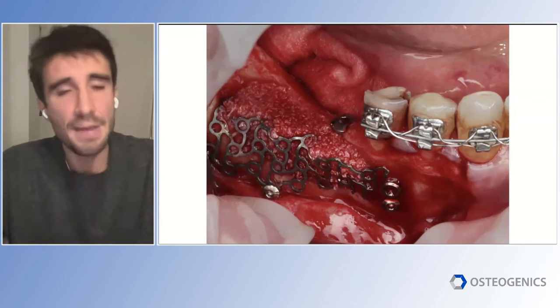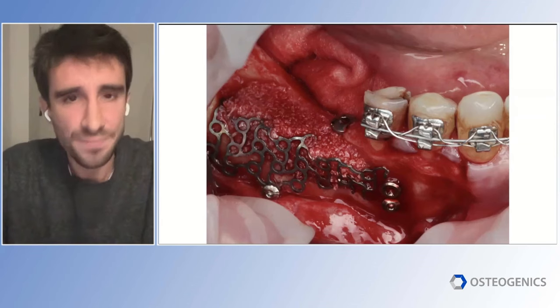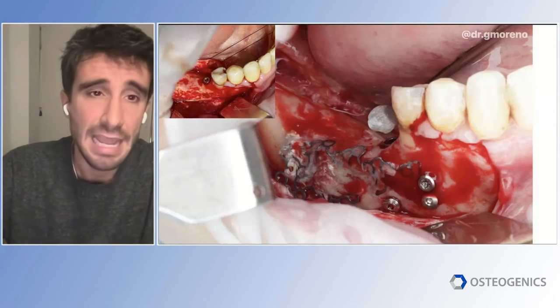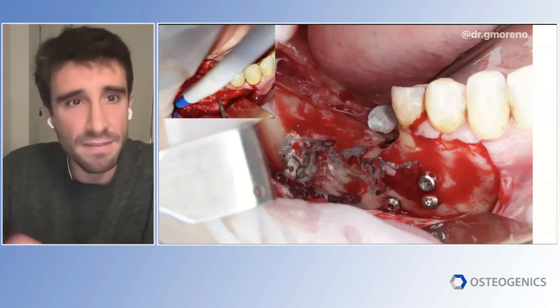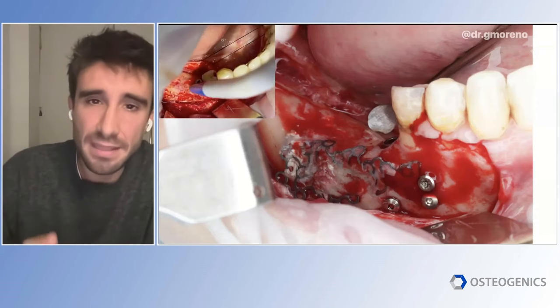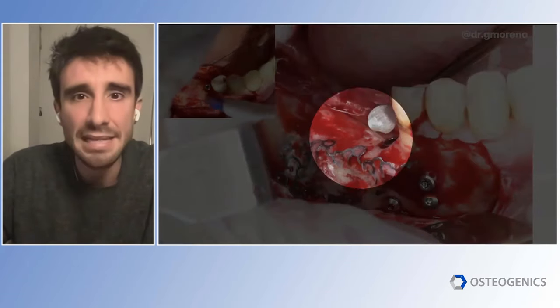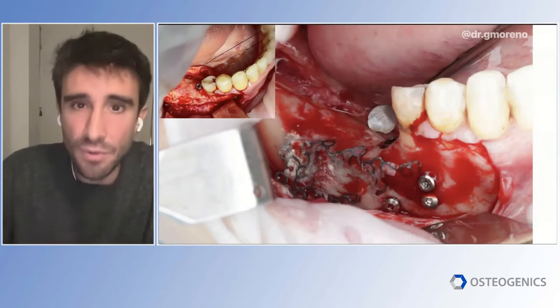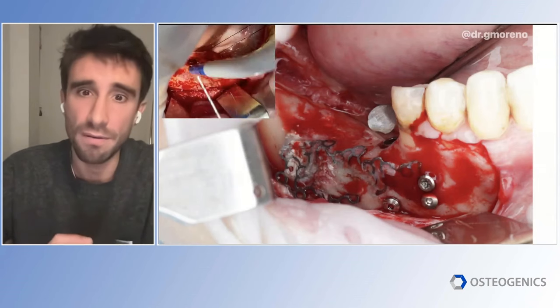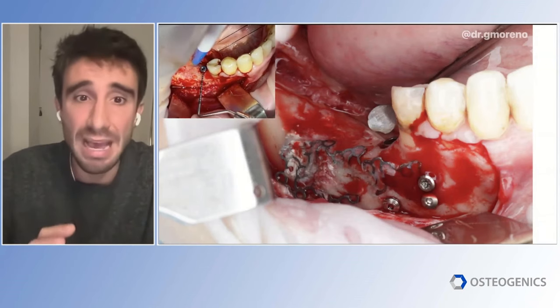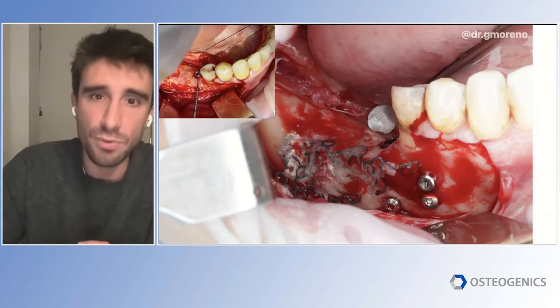The position of the titanium mesh exactly matches what we planned, creating exactly the intended volume and grafted area. We fill the space with 100% xenograft and cover with a collagen membrane. Once again, no pyramidal-shaped crest — we have a perfect rectangular-shaped crest with the angle between the buccal and crestal parts clearly visible. The biggest bone gain is at the most crestal part, around the implant connection, exactly the crest we intended to build.